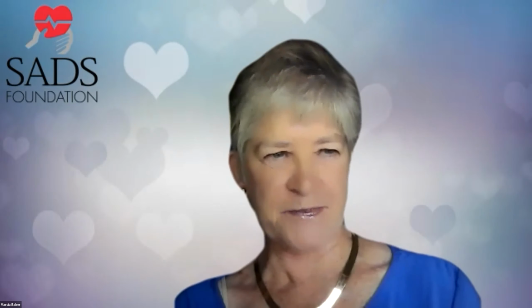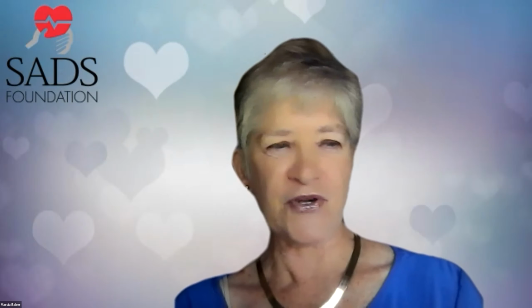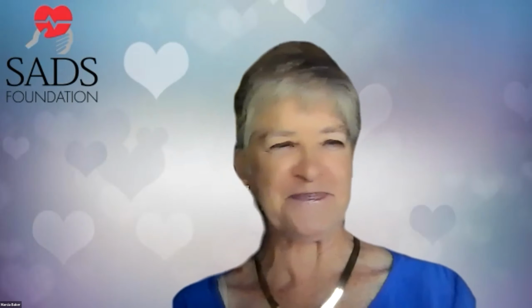Okay, thank you. Kelly asks, any chances of a smaller device? She's a petite woman and these S-ICDs look huge. Yes, so they have gotten smaller from the original iterations. The companies are always trying to make them smaller. I think we're at a point where the transvenous devices can't really be any smaller.